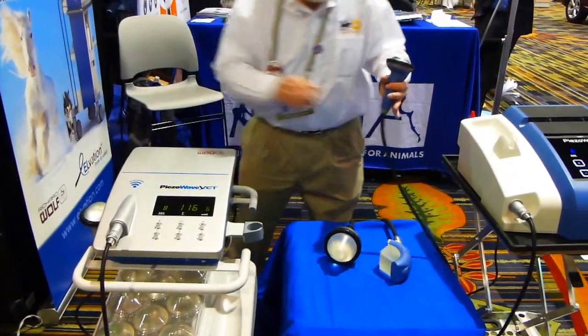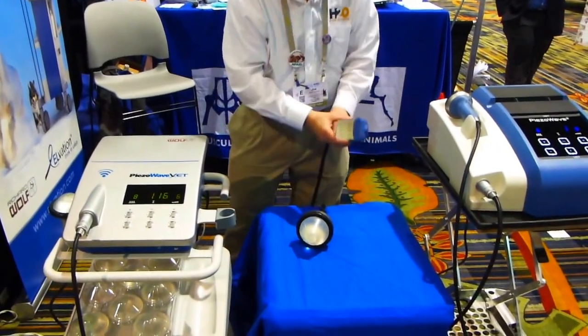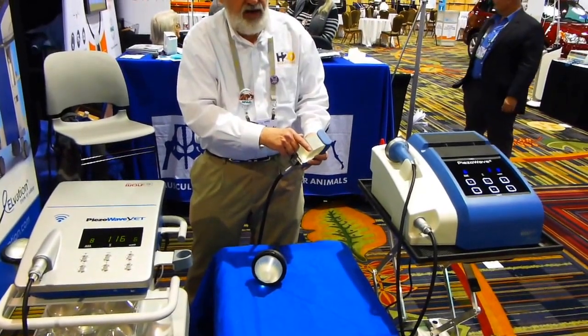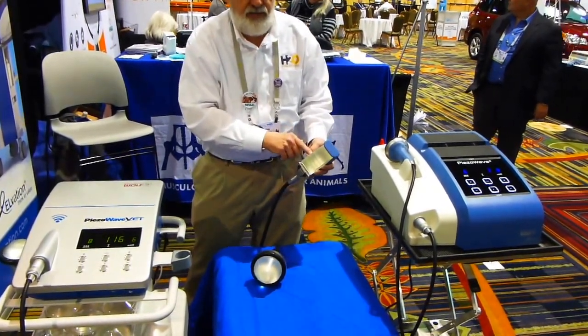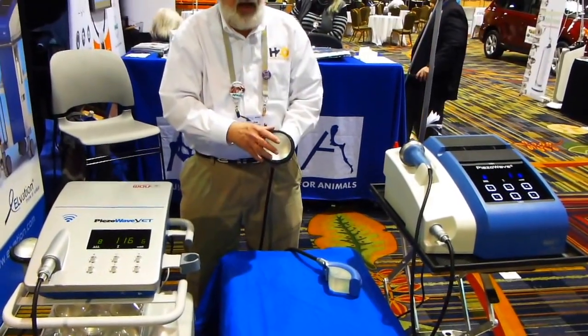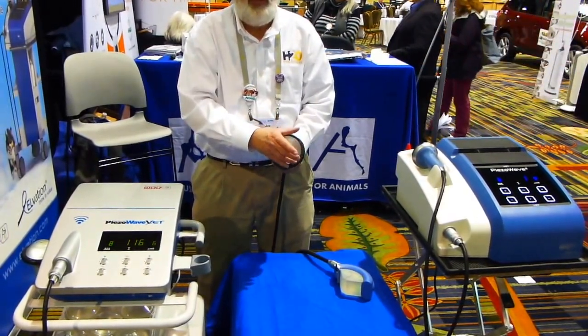We have the FBL, which is a unique technology for the Richard Wolff machines. It does a shockwave that's five millimeters wide by 45 millimeters long by up to 20 millimeters deep. And then for large animal and equine, we have the F10G6, which goes 60 millimeters deep.